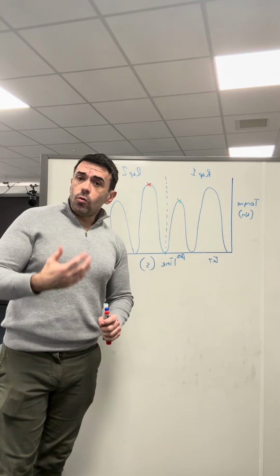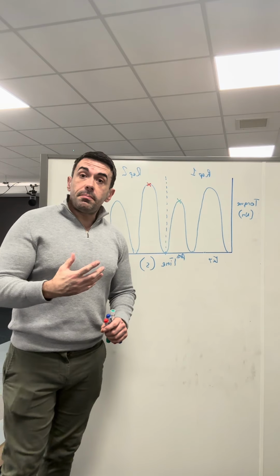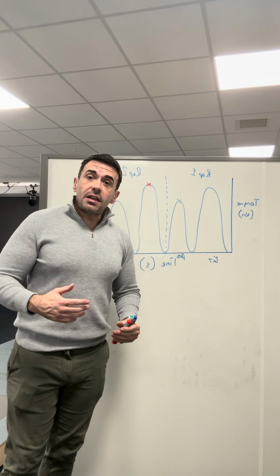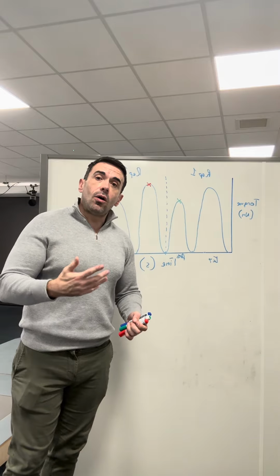However, the more repetitions that are performed, the less useful this measurement is. Remember that any maximum or minimum value, like peak torque, is by definition an outlier. It is the maximum value. It is not representative of the set as a whole.